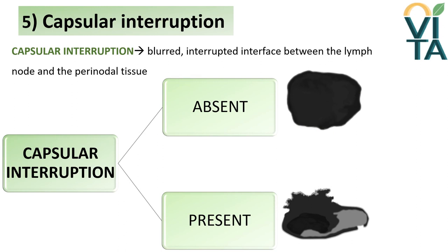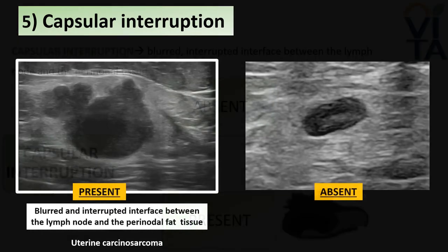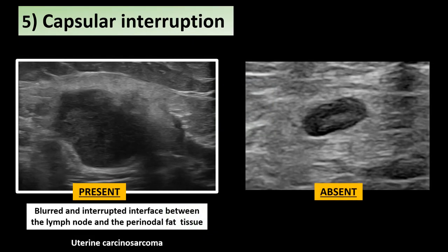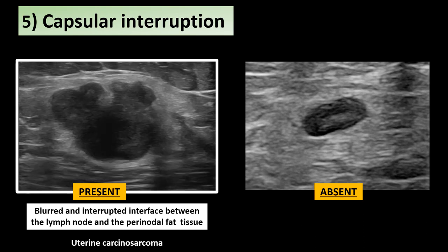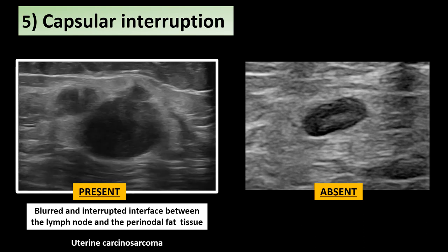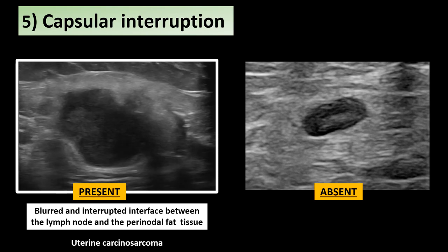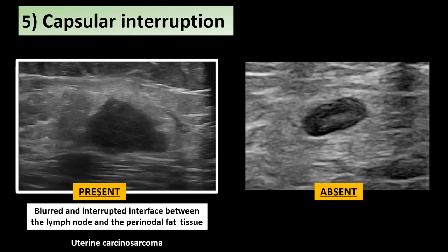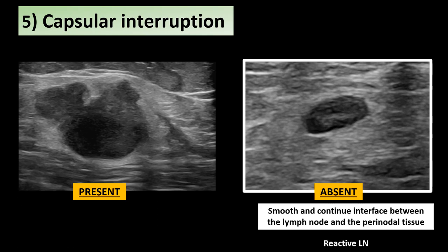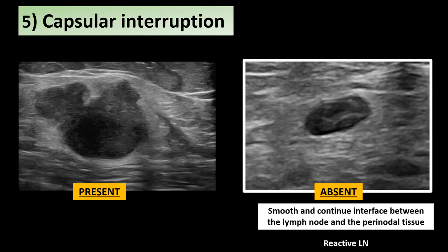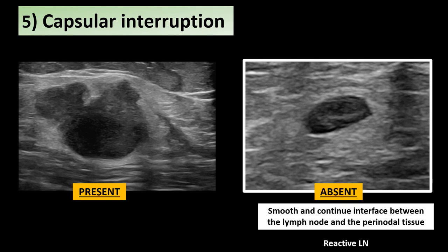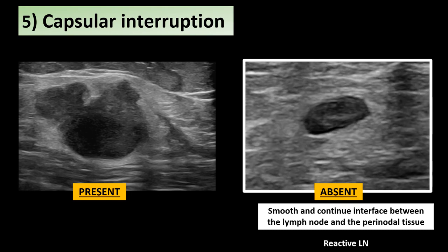Capsular interruption is seen as a blurred, interrupted interface between the lymph node and the perinodal tissue. It should be reported as present or absent. On the left, in a metastatic lymph node from carcinosarcoma, the borders are blurred and irregular and the capsule is interrupted due to projection into the perinodal fat tissue. On the other side, in a normal lymph node, the surrounding capsule is smooth and clearly separated from the perinodal tissue.